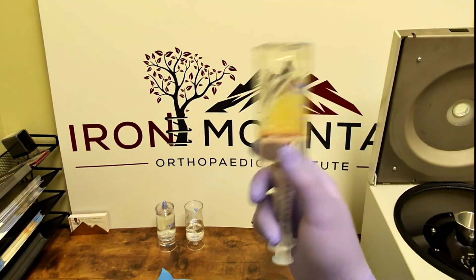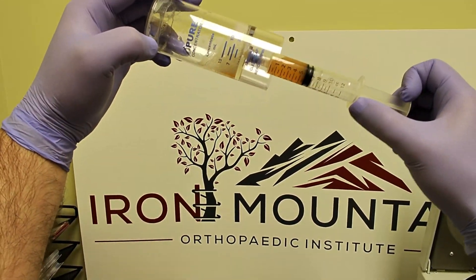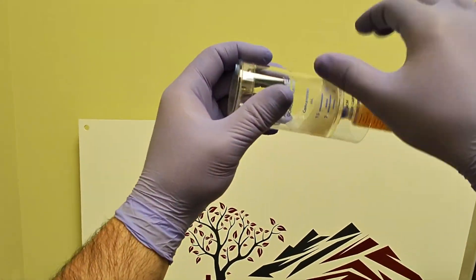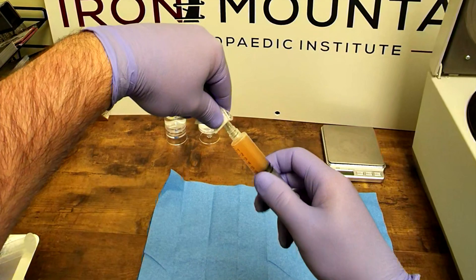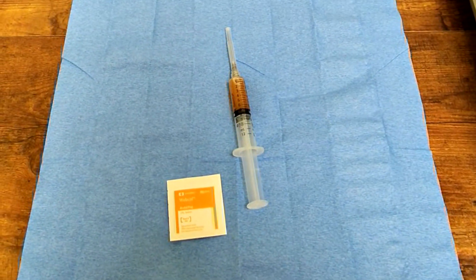Care is taken to continually evaluate the device to ensure all the platelets are suspended. Once resuspended, the platelet-rich plasma is extracted into the injection syringe and the preparation process is complete. The PRP is then ready to use for the procedure.